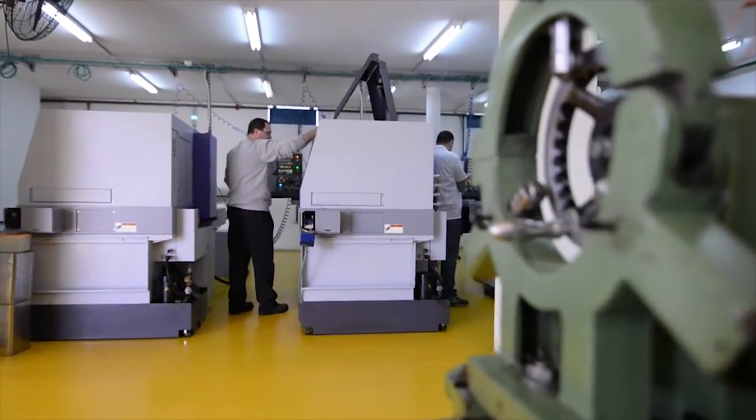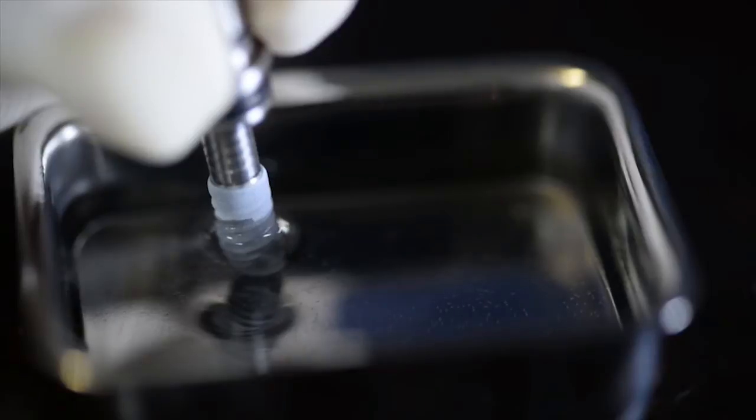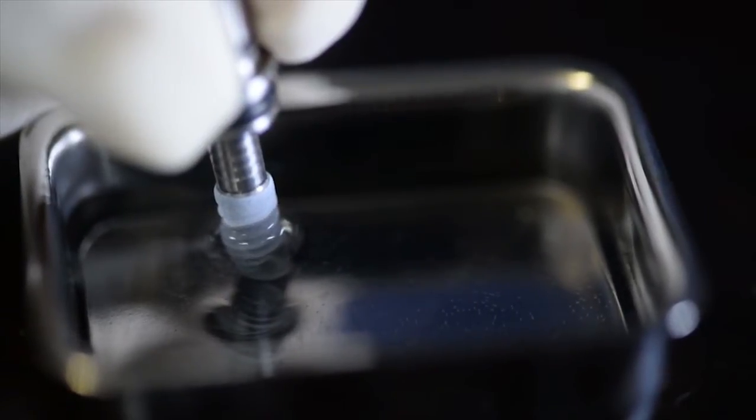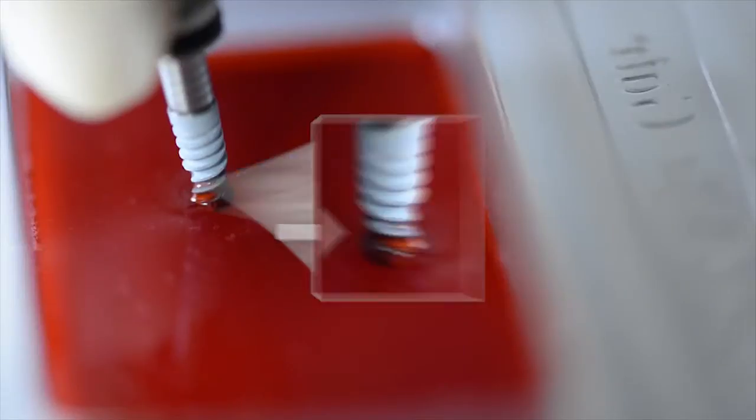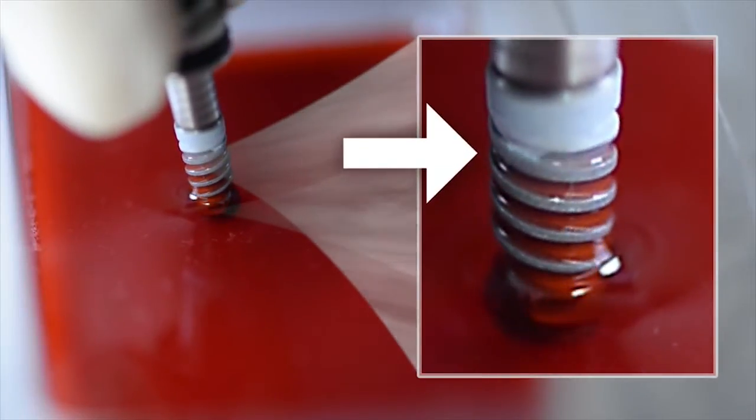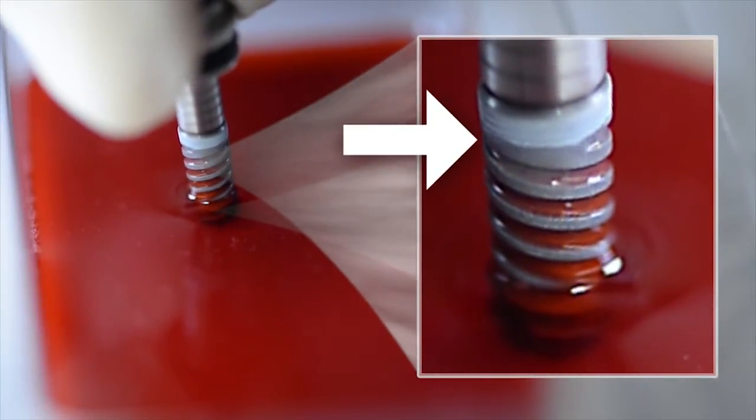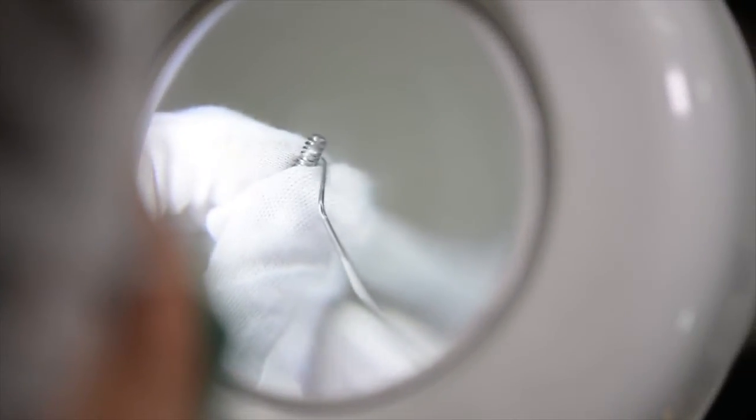Alphagate offers clients the most advanced dental technology. Third-generation implants are coated with synthetic bone specially designed to speed bone growth around the implant, creating a stronger attachment to the bone. This new process saves on additional surgery and is more pain-free than other treatments.